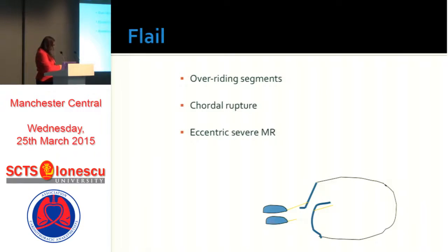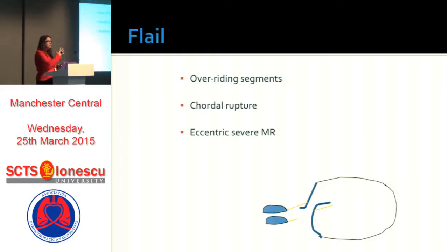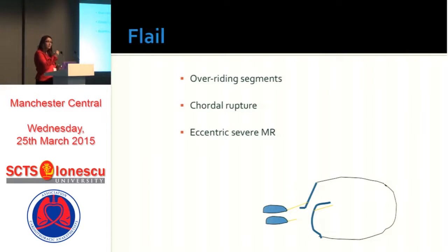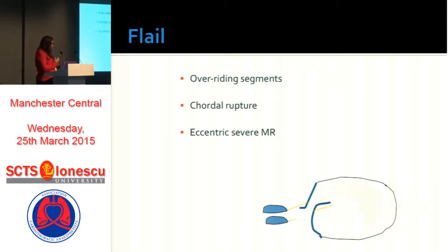With flail segments, as soon as you see a ruptured cord anatomically, that should trigger you to think you're seeing severe mitral regurgitation. If you're not seeing severe MR but are seeing that anatomy, you're either missing the regurgitation on color and need to search harder, or the flail cords are not actually to the primary cords — they might be to the secondary or strut cords. But if you have a primary cord that's flailed so that one leaflet overrides another, you usually do see eccentric, severe mitral regurgitation going away from the pathology.